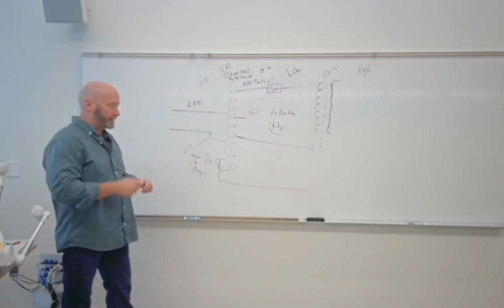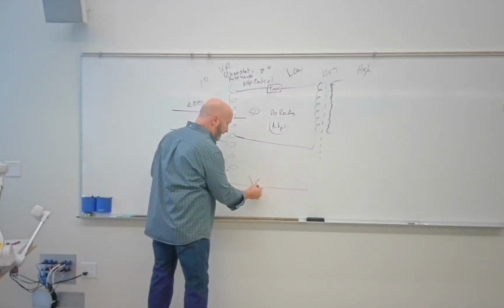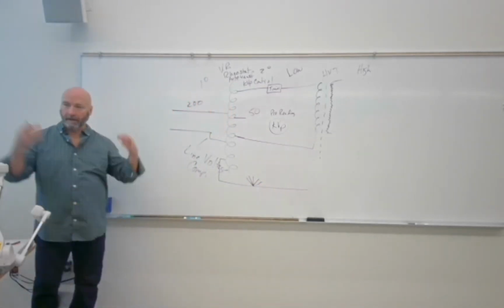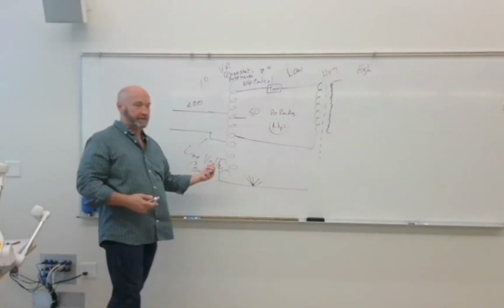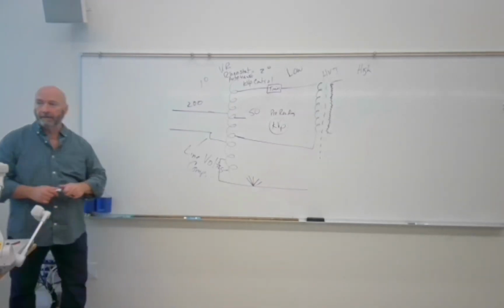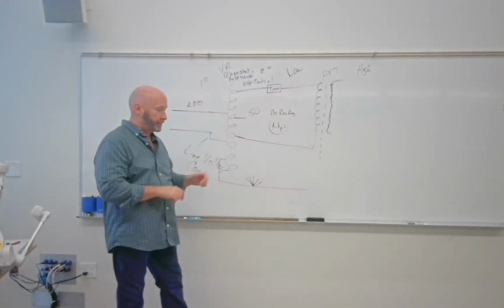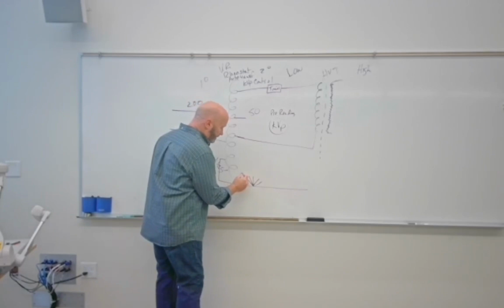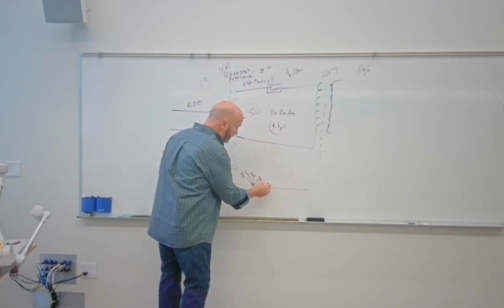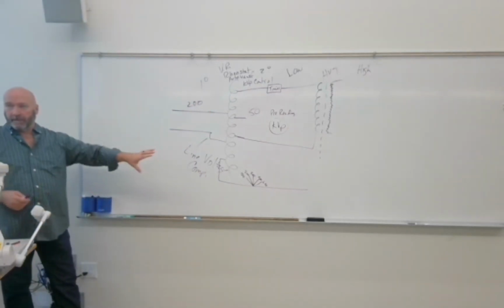So we have two things down here. We have another rheostat, and it's always going to be drawn kind of like a bush in the wintertime when all the leaves fell off. It's just sticks sticking up. And what we're going to control here is our mA. It's basically a rheostat as well. We can increase or decrease the mA, and it usually goes something like 100 mA, 200, maybe 300, 400, and 600. Your machine may have slightly different ones. So it's just mA.